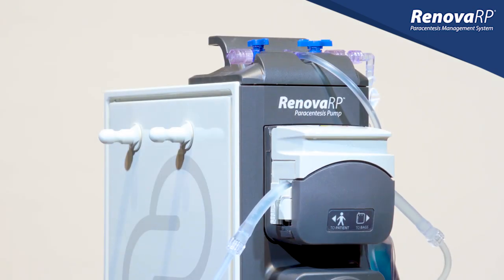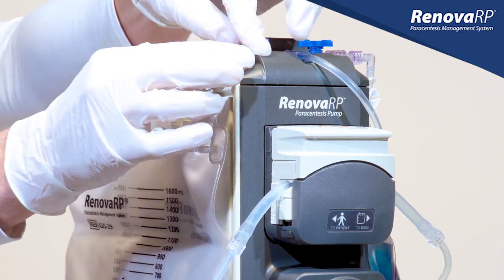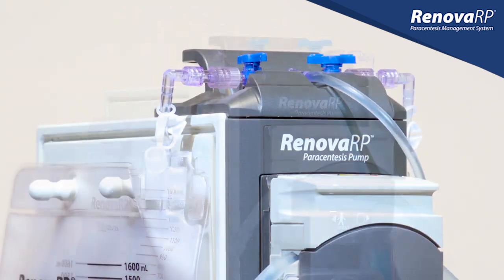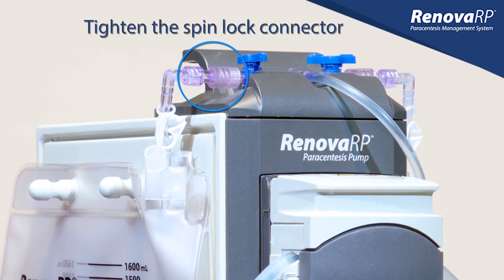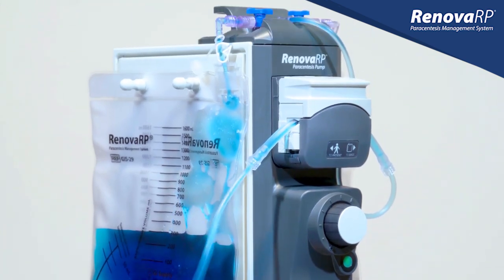Once the full bag has been removed, we replace it by following the original procedure for connecting a bag. Ensure you have firmly connected the bag to the T-connector and that you have tightened the spinlock connector. This bag change procedure is repeated until the fluid drainage is complete.